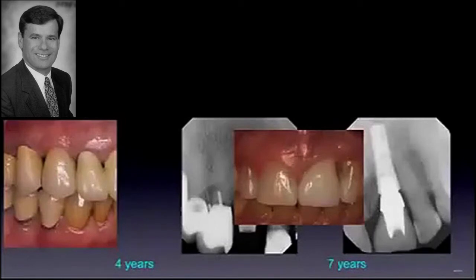And here is a case where it was maybe placed a little close to the lateral, and yet, when you look at a 7-year radiograph, you see virtually no bone loss. As a matter of fact, you may even argue there's bone on the bevel. So this implant, in terms of its design feature, has lost virtually no bone. But the problem is that you look at this case, and you look at the results of this case, that this patient 7 years later, compared to, say, an implant placed at the crestal position, which this is the canine, and you could argue on this elderly lady, this is the healthiest thing in her whole mouth.